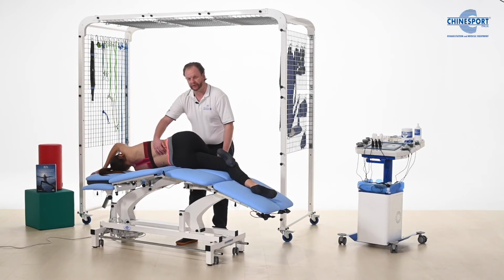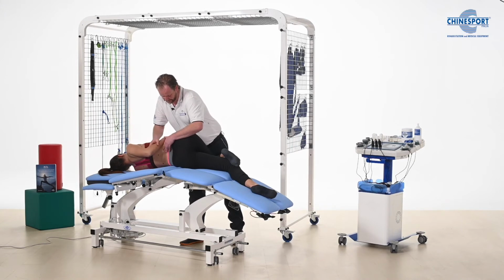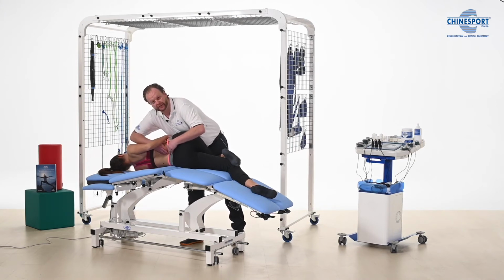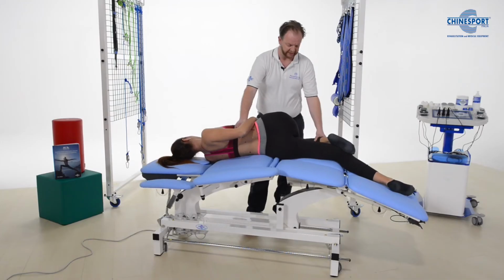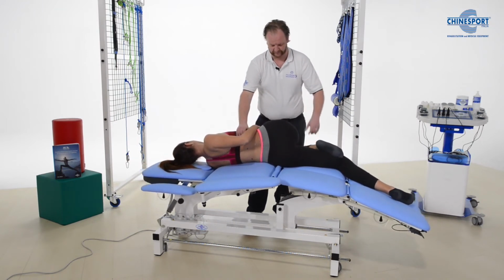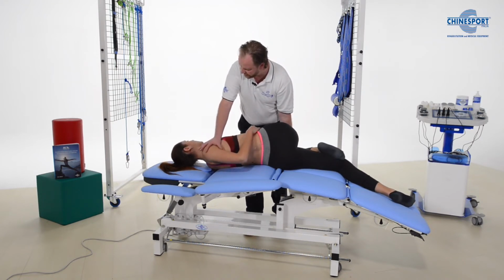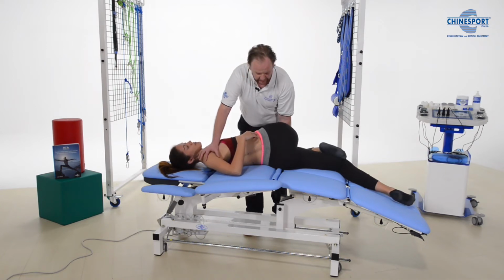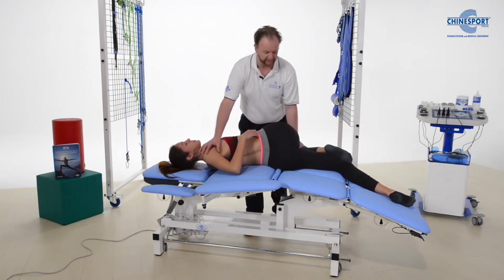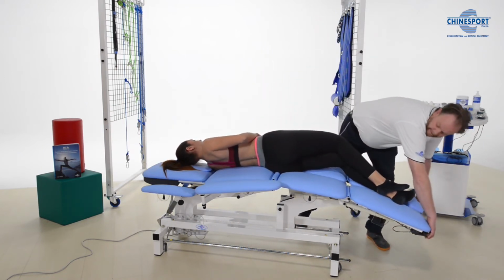Mobilizations are made easy. We can go into side bending. We can start our mobilizations here per segment. Or we can have a more global mobilization where she breathes in and out, and looks towards the other side. Just look towards the other side. Okay, and we can also provide an impulse if we want, so that we get some joint cavitation.